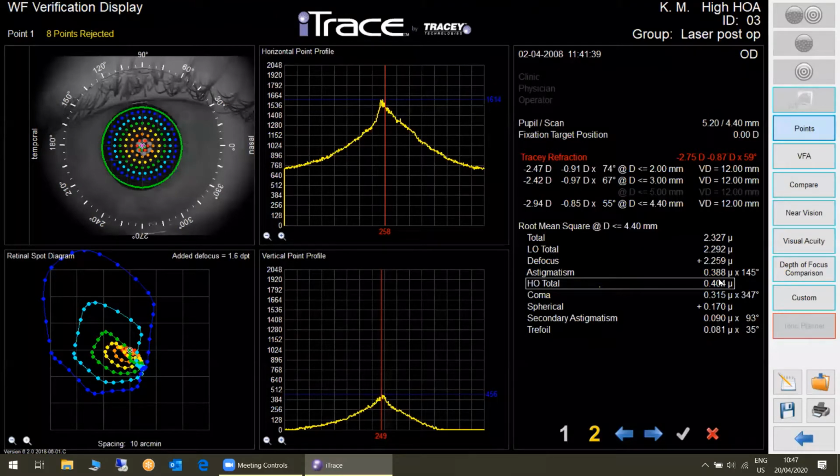Now I'm wearing reading glasses because I just turned 50 the other month. If I take them away, I can't see the numbers, but I could easily see that the color of the refraction is red. This color of this refraction is linked to this number. We have a quite sophisticated algorithm that will translate this higher order total number into the color of the refraction. If the color is green, you can refract that patient to 20/20 or better. If it's yellow, there might be a problem. If it's red, there are problems. So here we know the patient has problems.